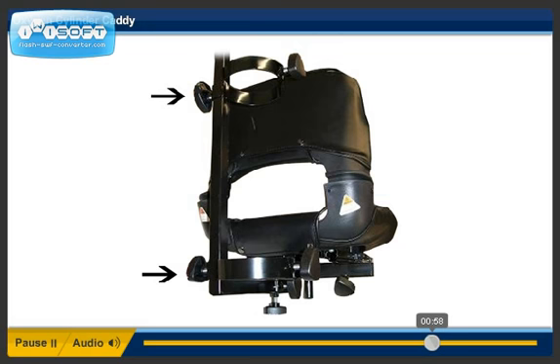Step 8. Install the upper cylinder holder on the L-bracket. Position the bracket at the height that will accommodate the size O2 cylinder that is being used.